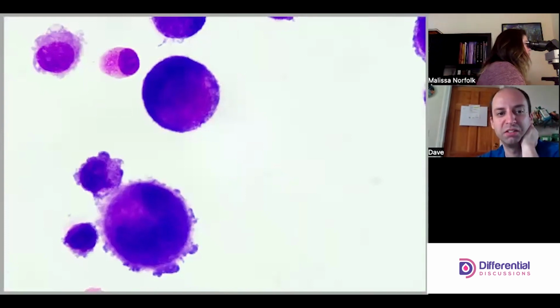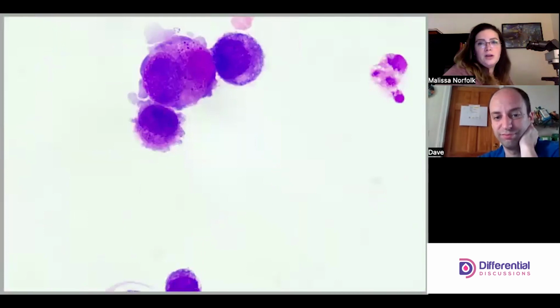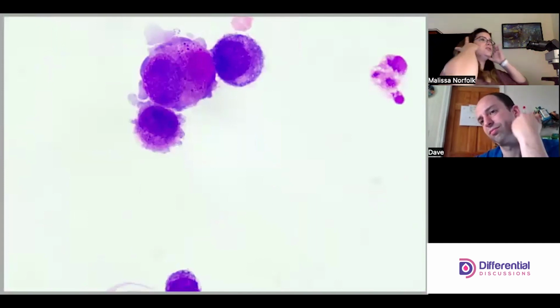These are all WTF cells, to be frank. And some of them are very large, some of them are very small. And honestly, I think that's just a product of them going through mitosis. Sometimes we catch them right after they've gone through mitosis, so they're very small, and right before they go through mitosis, so they're very large.